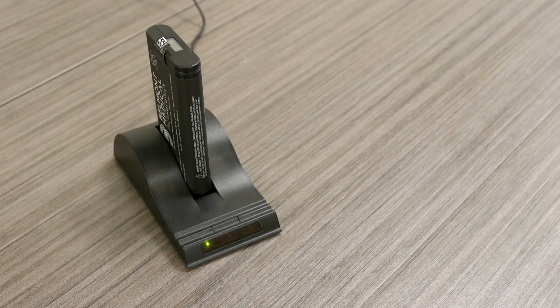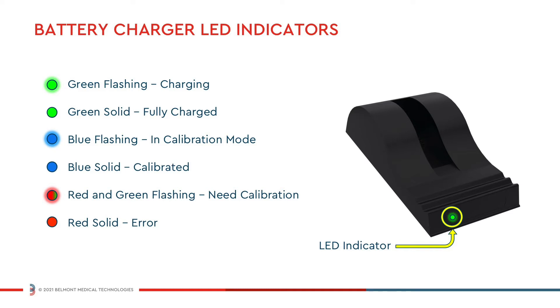The charger will automatically begin charging the battery. LEDs in the charger status window will provide status information. It will take approximately 2.5 hours for a fully discharged battery to become fully charged.